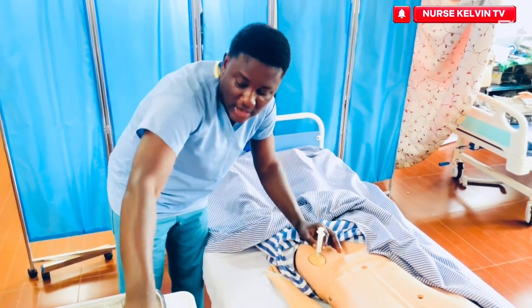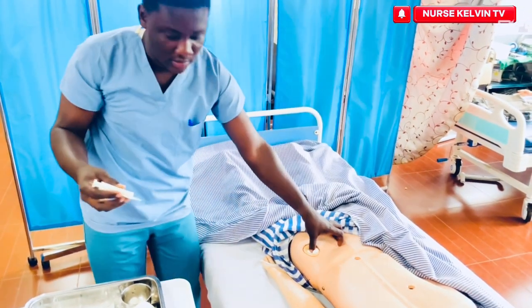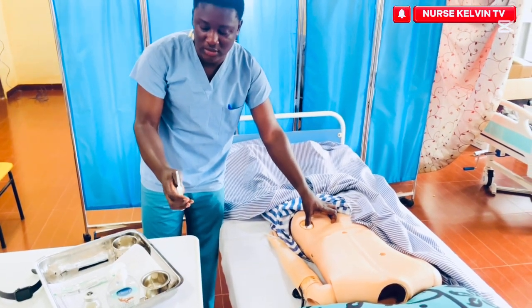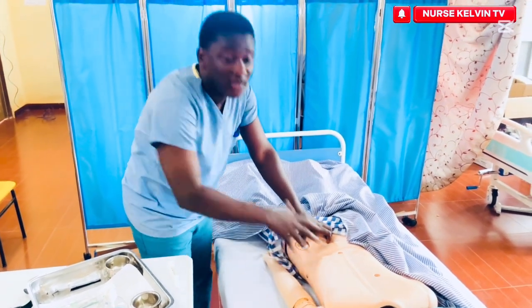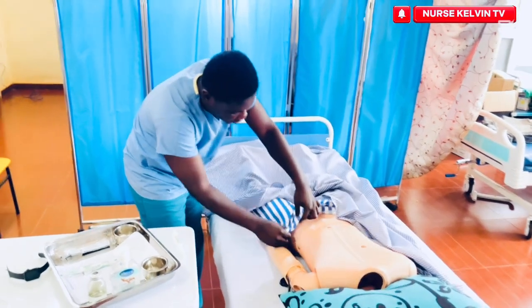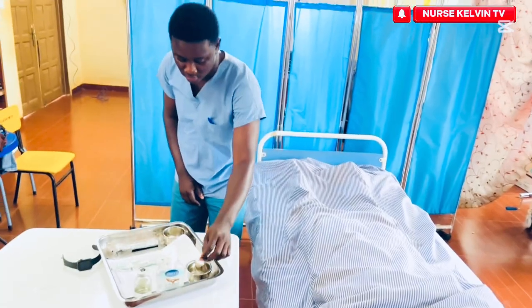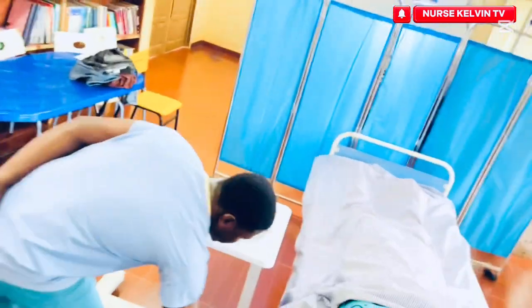Right after you are done, quick, you apply the dry cotton like this. Then you cork the syringe, then you dispose of it. Then you do like this, quick. Then you close the patient. Afterwards, you dispose of your syringe in the safety box.